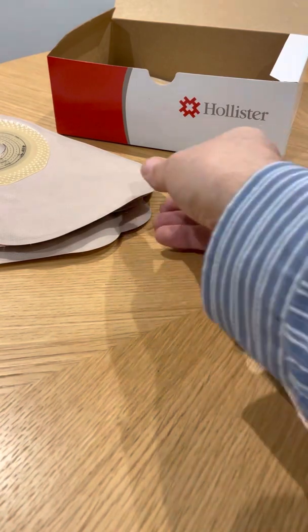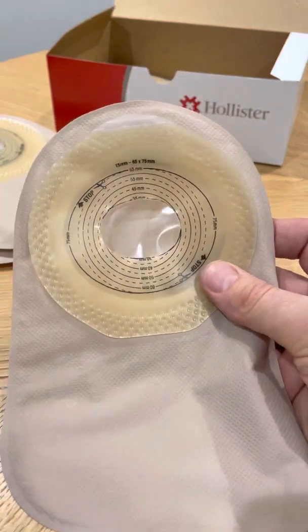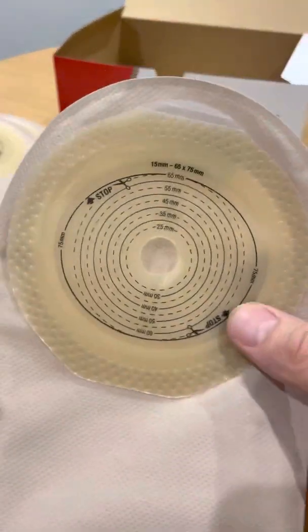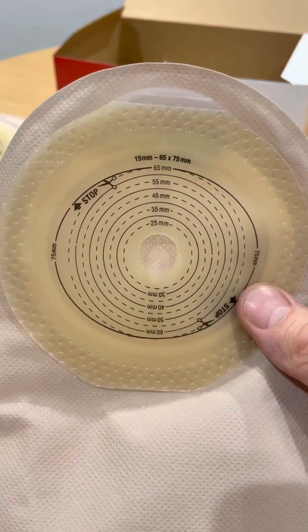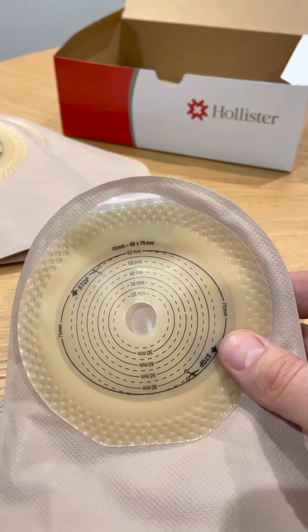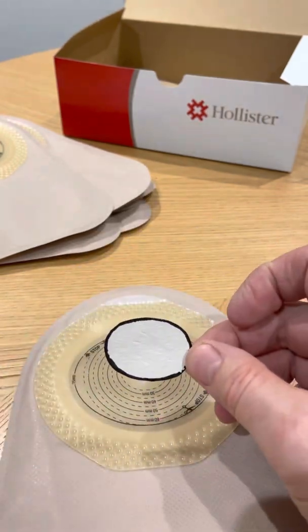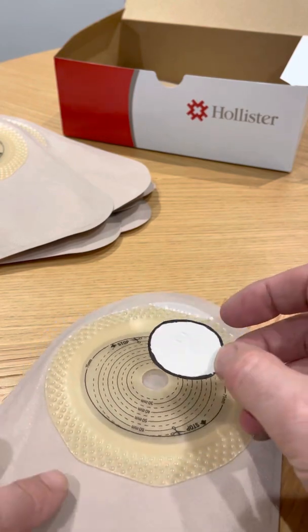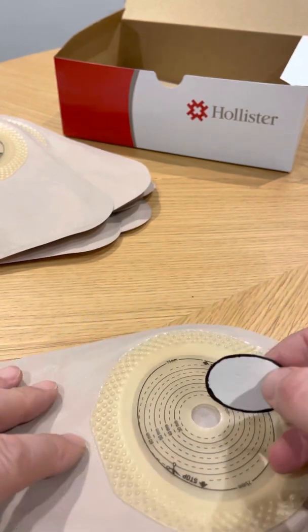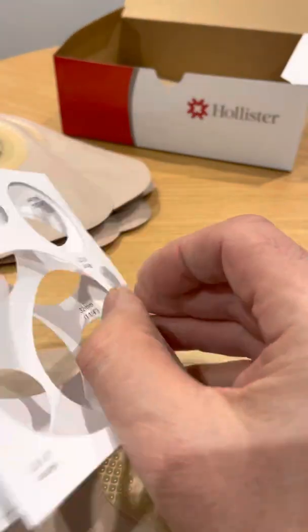Here's a quick and easy way to cut the right shape hole in a stoma bag. Stoma bags come with a small hole already in them, and if the hole you require is different, then you can create a template. I use a positive template as I find it easier to draw around, but you could use a negative template, as in one of these.